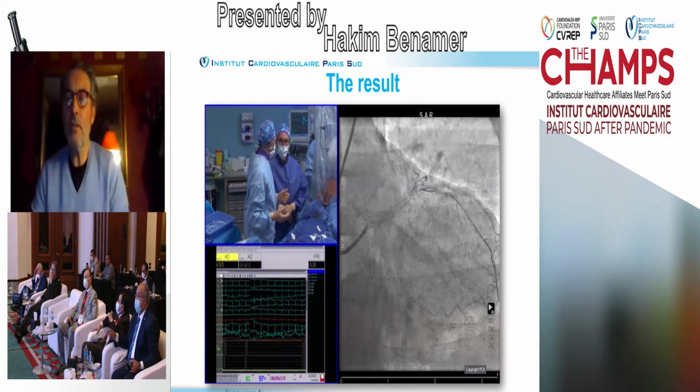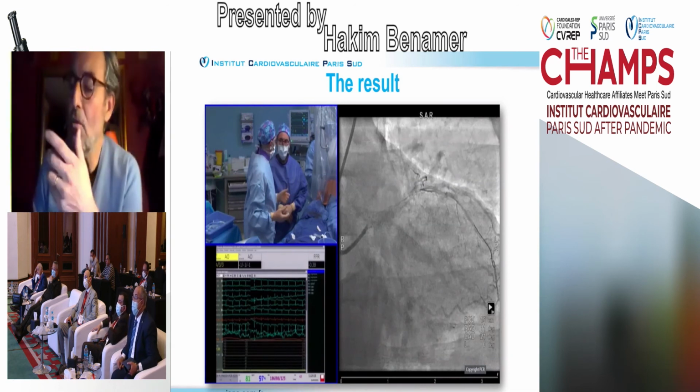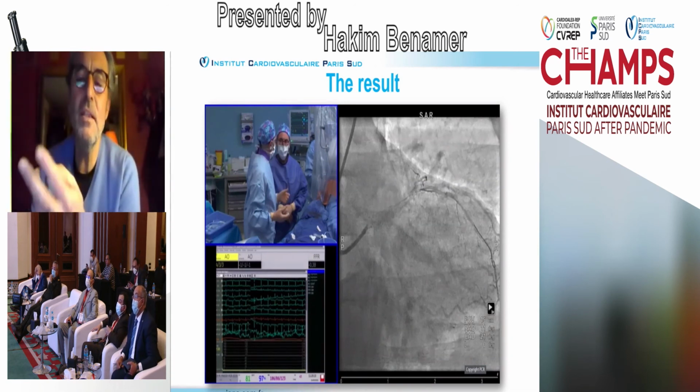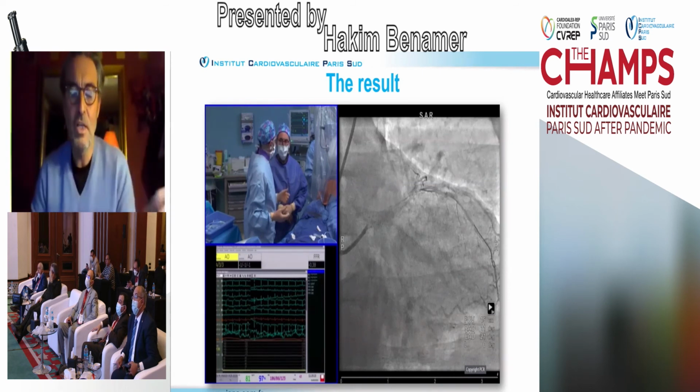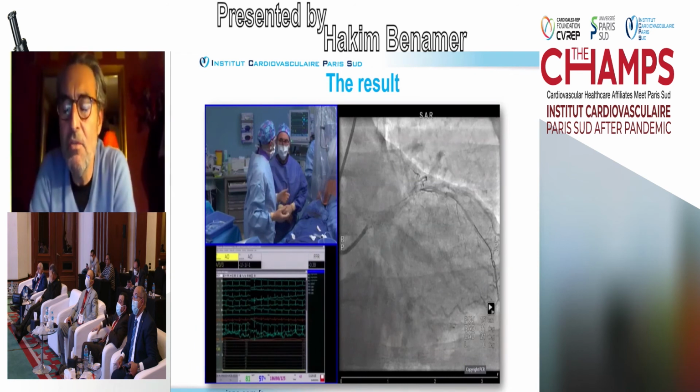What about? That's the question. No, you can do the kissing. You don't have to do high pressure inflation on the ostium of your side branch, especially if the side branch is not diseased.